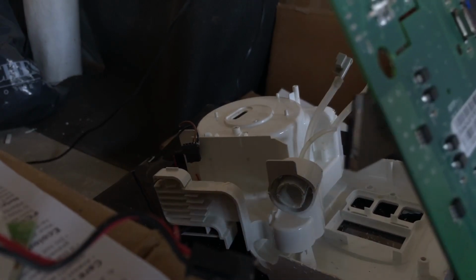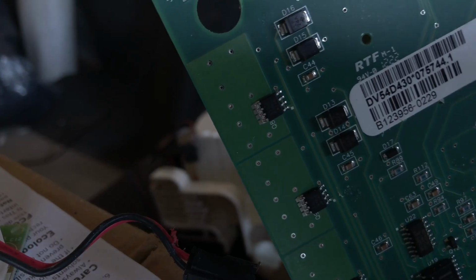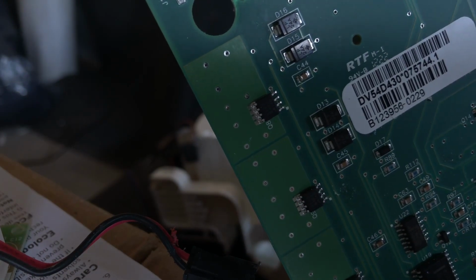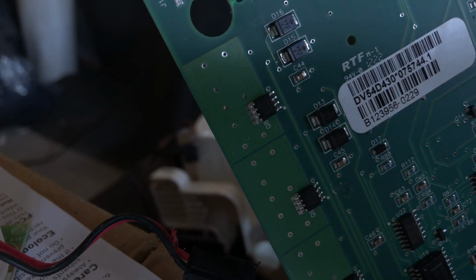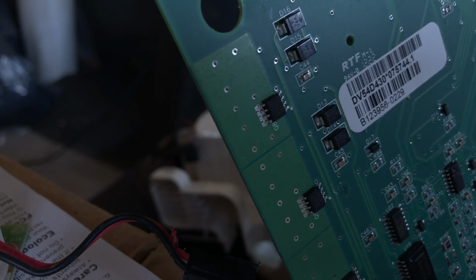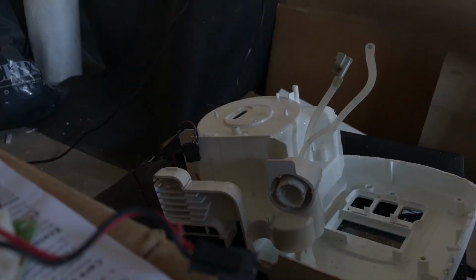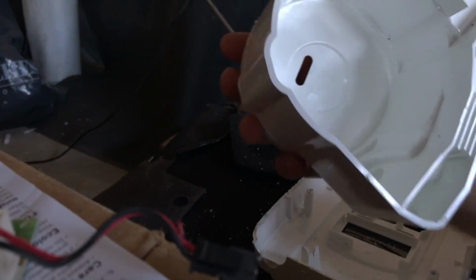It says 12/22 over there above the sticker. So I put it to the 22nd week of 2012, which is probably around the age of this thing. It's about 10 years old. Yeah, so there you have it. And the rest is just basically this big plastic housing.